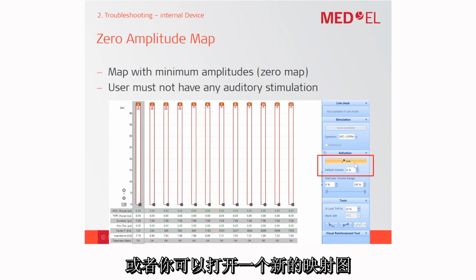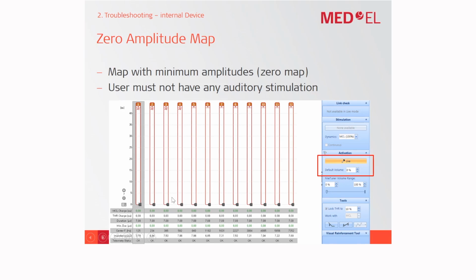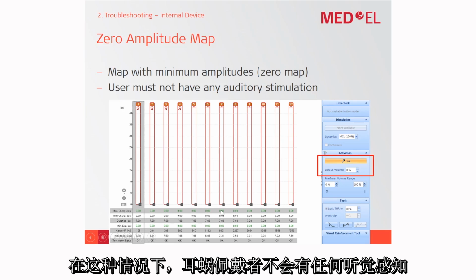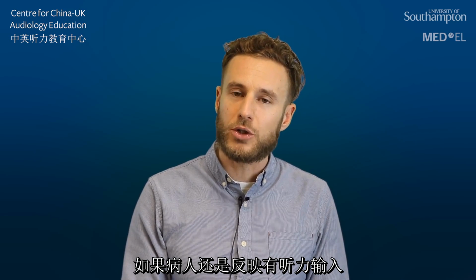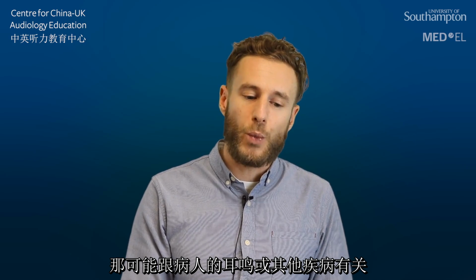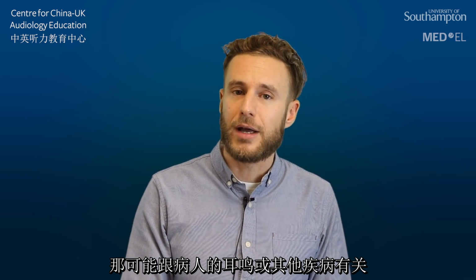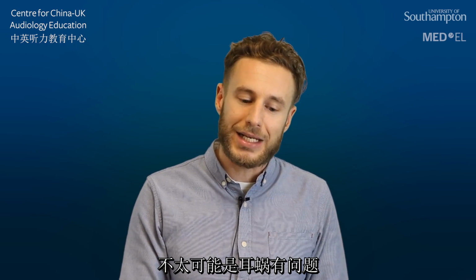For sure you could do this also from scratch when you open a new empty map and then set your default volume here to 0 while the processor microphone is activated. In such a situation, the CI user must not have any auditory perception via the implant system. If the patient still reports auditory input, then this is possibly associated with tinnitus or other medical issues which are not necessarily related to a technical problem.